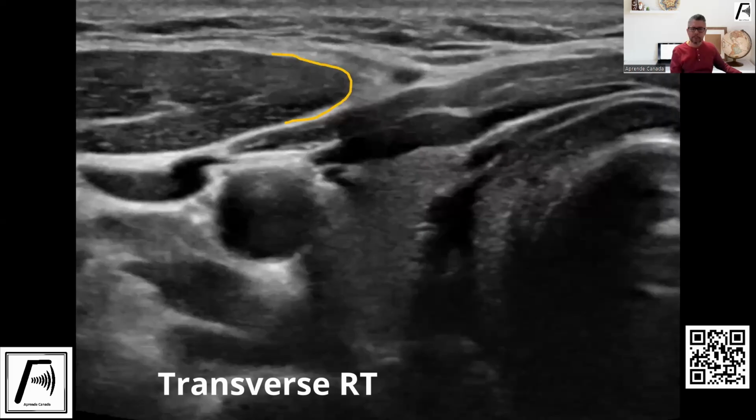And then here in this particular case, we can see how that shadow almost darkens the entire thyroid lobe. So obviously this is going to affect the visibility. So I'm sure that you have seen this type of refraction, this type of shadow when you scan. And so what can we do in order to get rid of it?